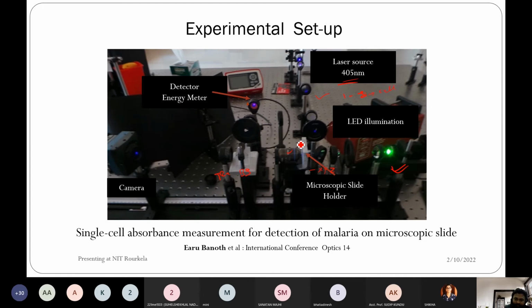So my beam spot is supposed to be very narrow, around 10 to 12 micrometer. Generally, with any laser diode you can identify a beam diameter of around 1 mm to 2 mm. But I made that 1 mm beam into a 10 to 12 micrometer beam diameter.